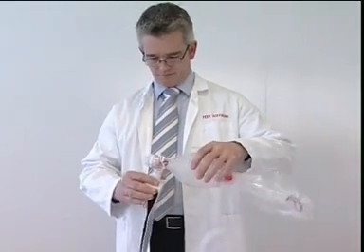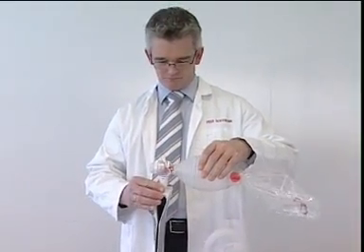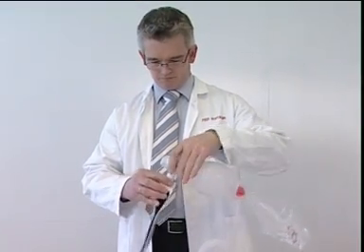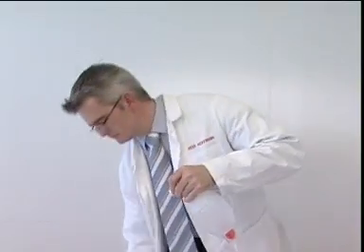Before use, test that the SPUR II is functioning correctly. The right testing procedure can be seen in paragraph 8 in the directions for use.